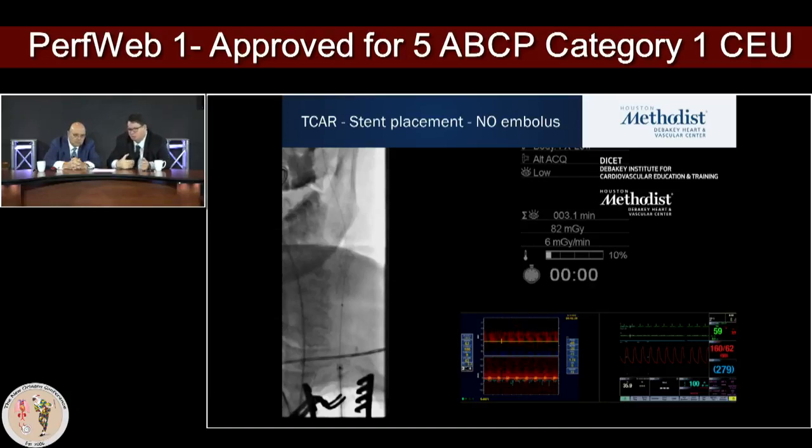So these are what we learn, and we can have thousands of cases, but this one video clip is worth more than 1,000 words in the New England Journal publication. I think this is where we need to be open and able to share our experience. And it's like, how can we get to this level?